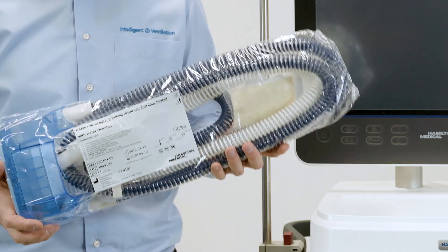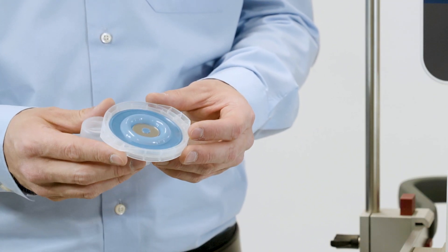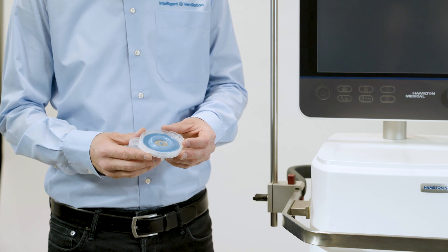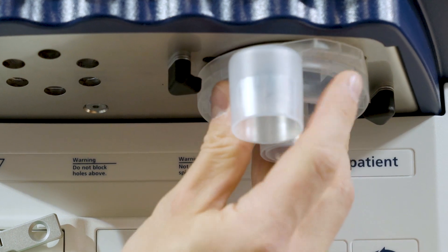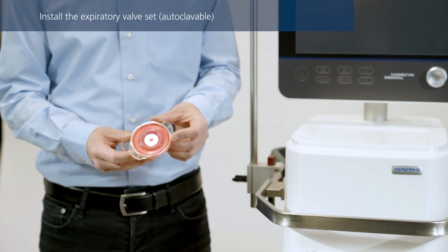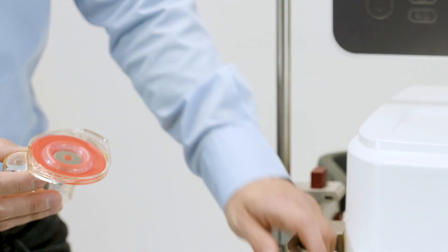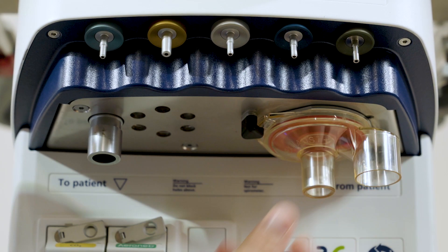If you plan on using a double limb heated breathing circuit, start by installing the expiratory valve set. The expiratory valve set is delivered clean and ready for use. Always check the set before using it on the patient. Position the expiratory valve set in the expiratory port and twist it clockwise until it locks into place. If you are using an autoclavable expiratory valve set, first assemble it by placing the silicone membrane onto the expiratory valve housing. Ensure that the metal plate is facing upwards, and then proceed with the installation. The procedure is the same as for a single-use component.